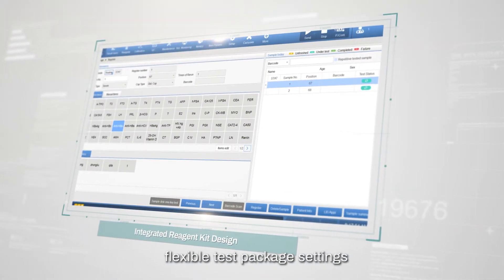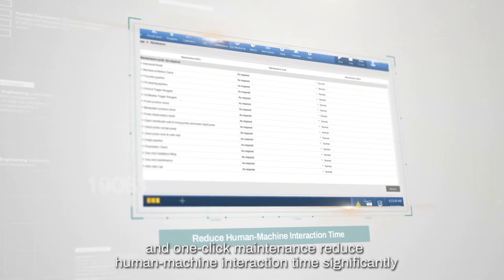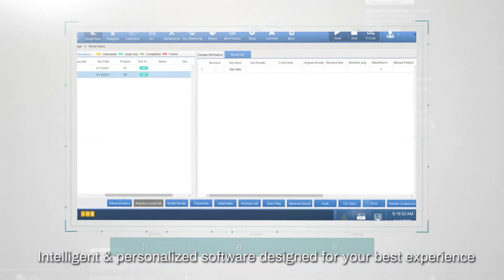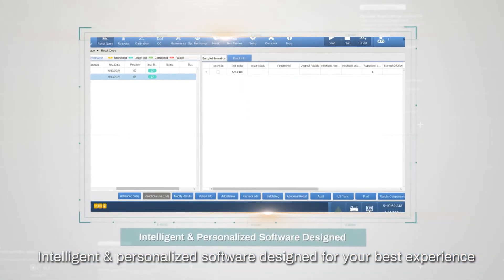Integrated reagent kit design, flexible test package settings, and one-click maintenance reduce human-machine interaction time significantly. Intelligent and personalized software is designed for your best experience.